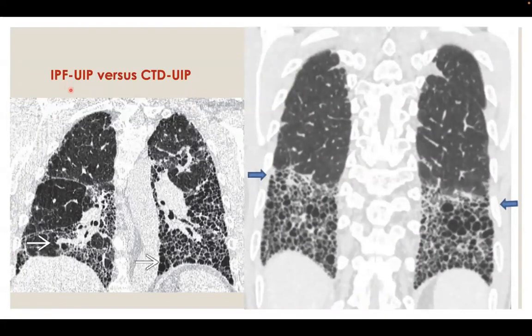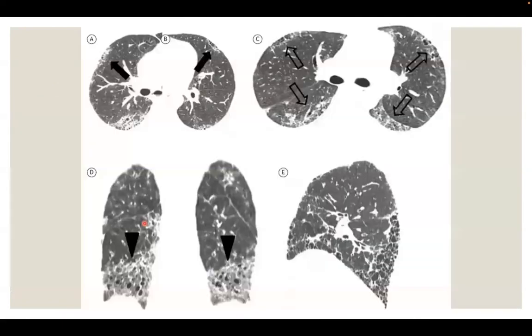In IPF UIP, there is extension of honeycombing to the upper lobes with an apico-basal gradient. To summarize, the four signs — anterior upper lobe sign, four-corner sign, straight edge sign, and exuberant honeycombing sign — suggest that the UIP pattern is secondary, most likely secondary to connective tissue disease.